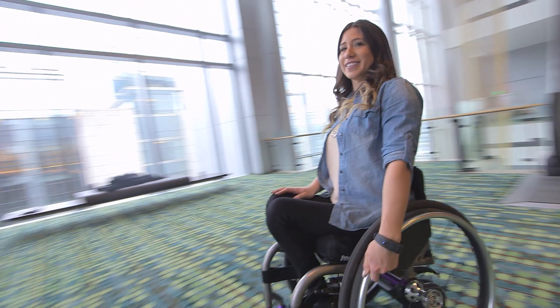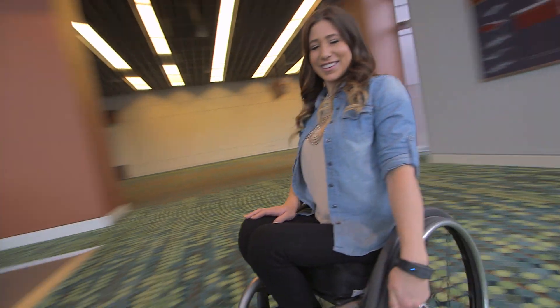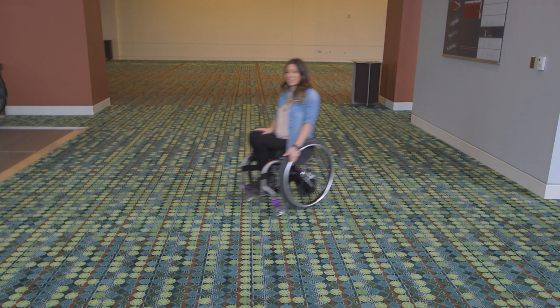To turn, just brake on one side or the other — it's just like turning while coasting downhill. The SmartDrive Omniwheel floats sideways on the ground, making turning easy.